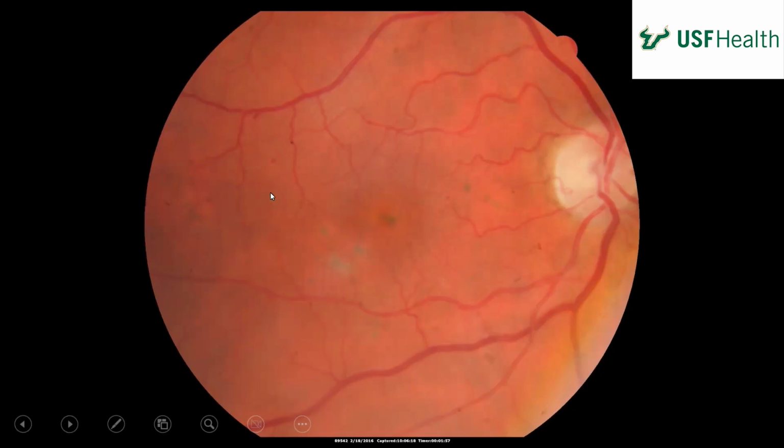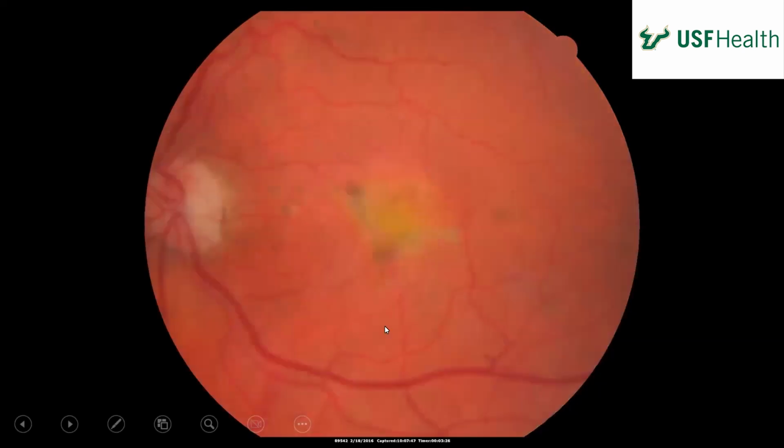Some of the spots on this image are on the camera. That's an artifact. But the spots you're talking about are real. These ones, this one, this one. This is a 2016 picture from our pre-wide field camera days. This is the old camera. Some of these other ones are from the camera, but these are real. Okay, you can see them there. This is the other eye.